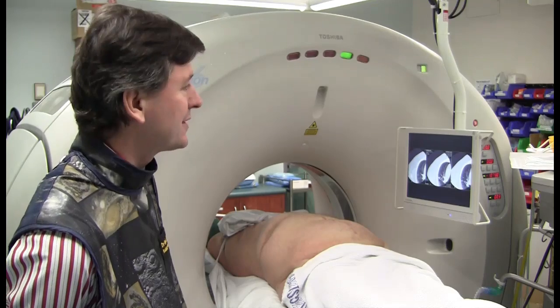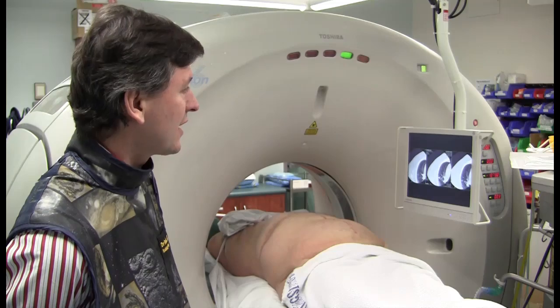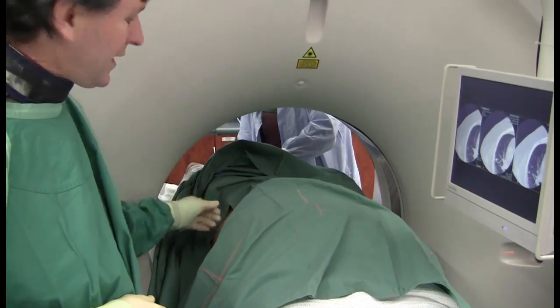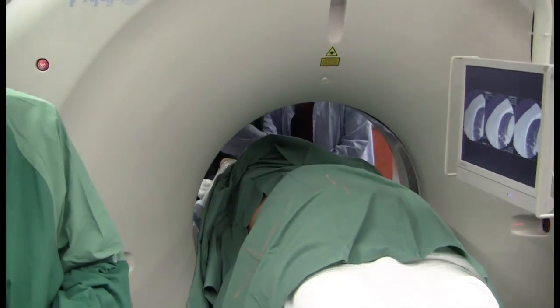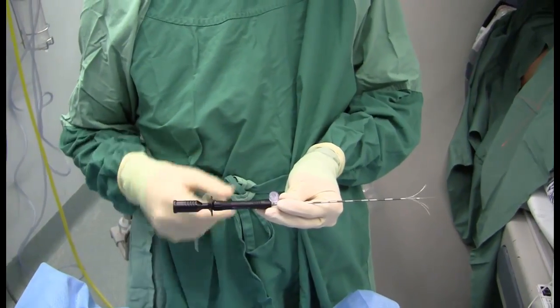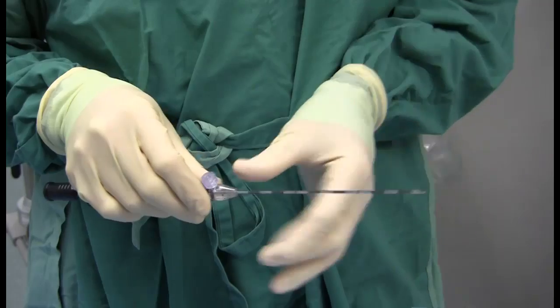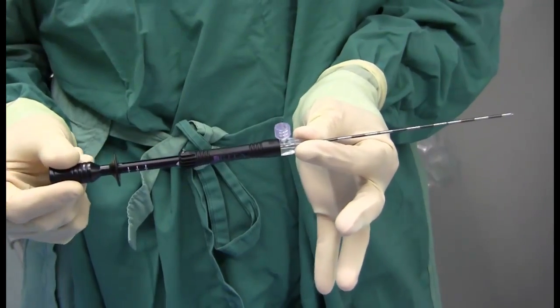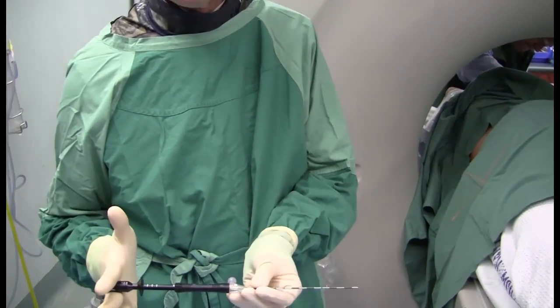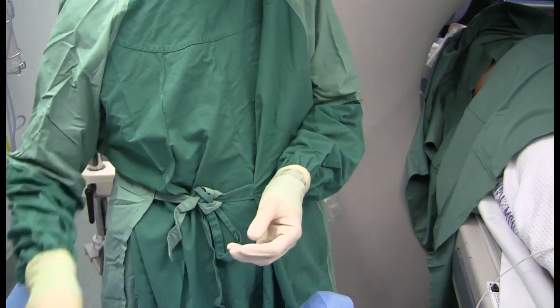We'll scrub up and get the procedure underway. We've now prepped and draped — the room is fairly tight. This is the Rita Starburst XL, which is a 25 cm probe from one end to the other. Fully deployed, the tines come out the end — it's a fairly substantial piece of kit. A straight perpendicular approach is simply not going to work in this situation because there's not enough room between the patient and the gantry. So we're going to need to oblique in to reach the target lesion today.